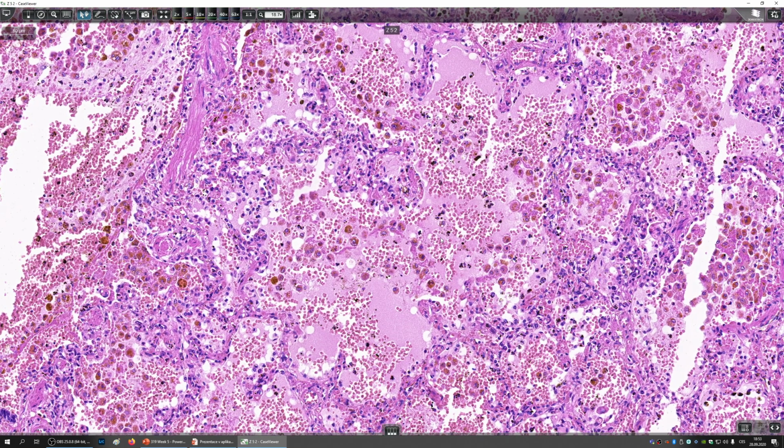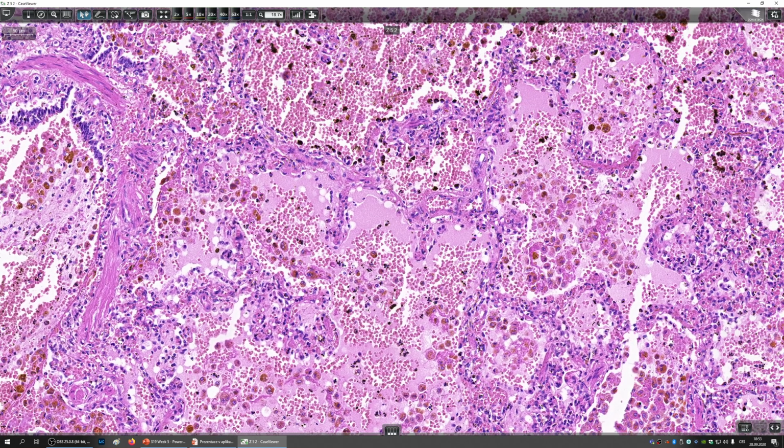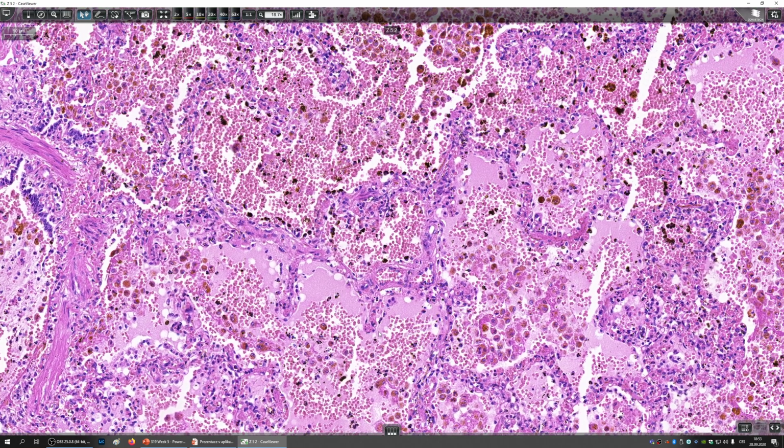So here you see that there was an acute exacerbation, like an agonal worsening, and this resulted in a lot of erythrocytes finding their way into the alveolar spaces. There are also some post-mortem changes additionally. So when the person dies, gravity works on the blood as well, so the blood pools in areas which are the lowest. So the basal aspects of the lung parenchyma, especially of the lower lobe, tend to be engorged with blood. So this is a mixture of agonal bleeding into the alveolar spaces plus the postmortem change of hypostasis.